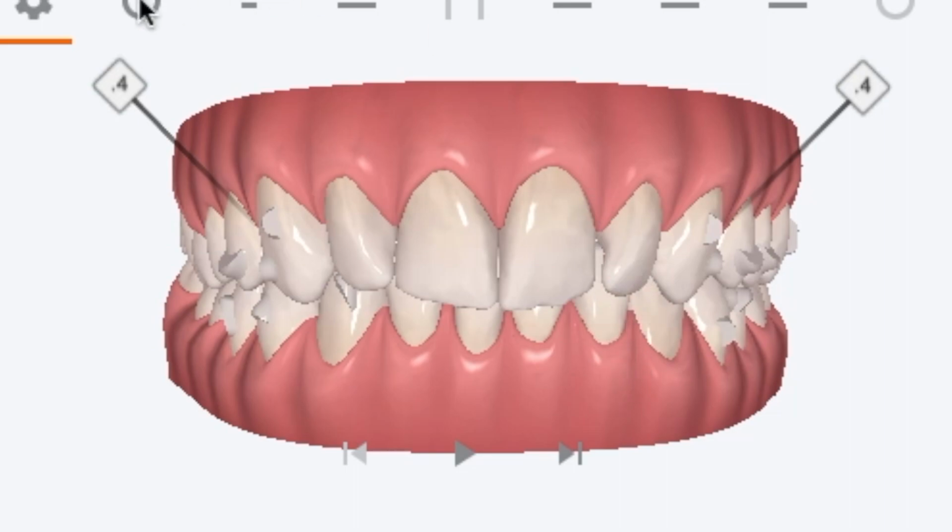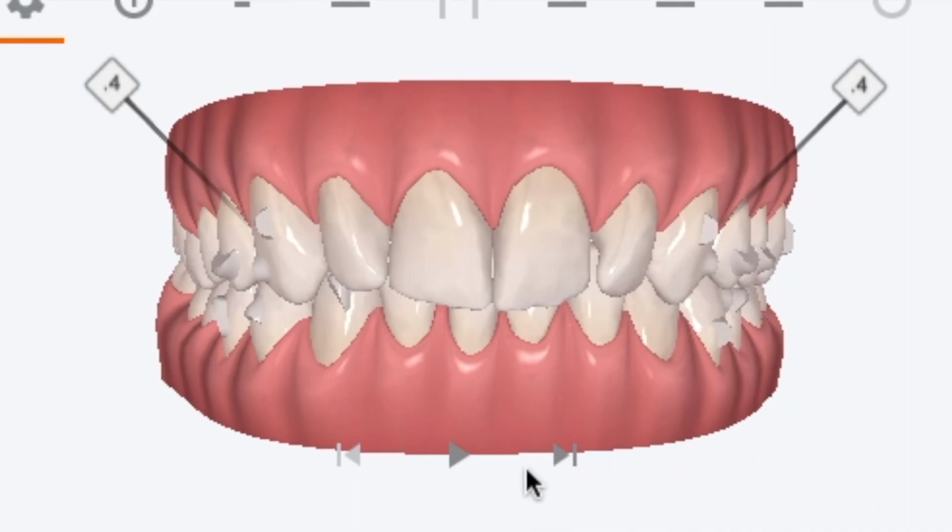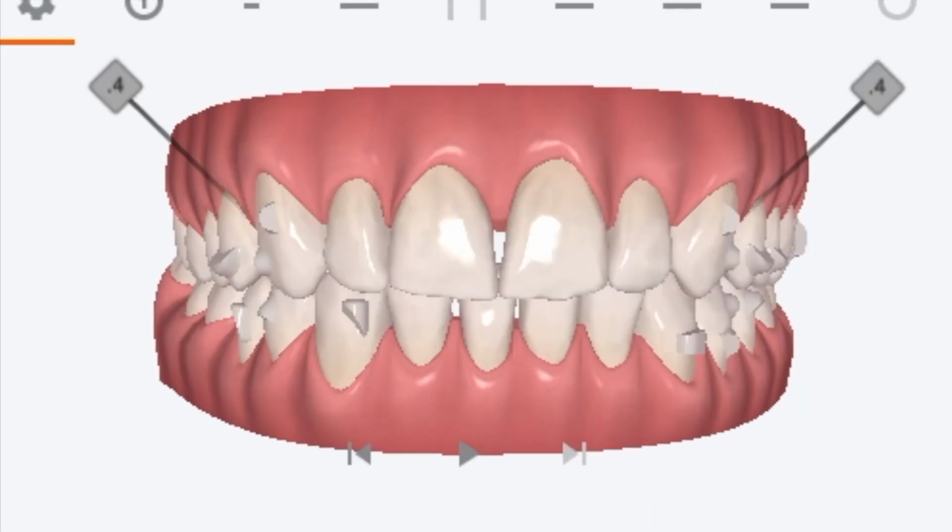Notice that my teeth all kind of pitch inward a little bit, except for the two teeth next to my very front teeth. I always call them the number 2 teeth because I can never really remember what they're called. So the number 2 teeth twist and pitch forward. From this view, you can't really see it all that well. But when I change the video from the first tray to the last tray, it's a pretty dramatic change.